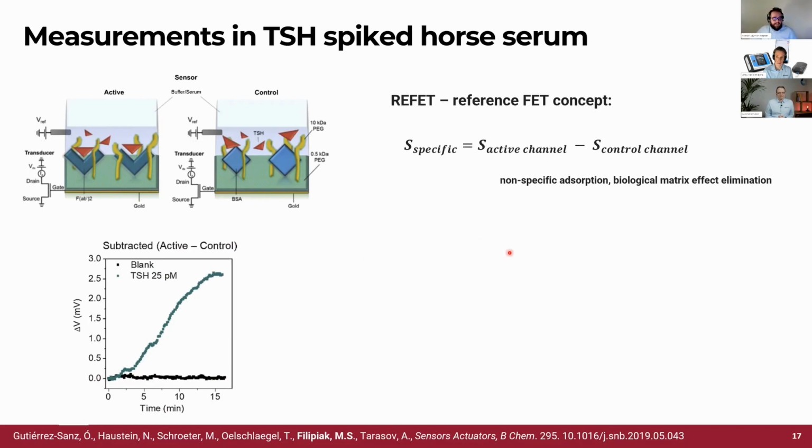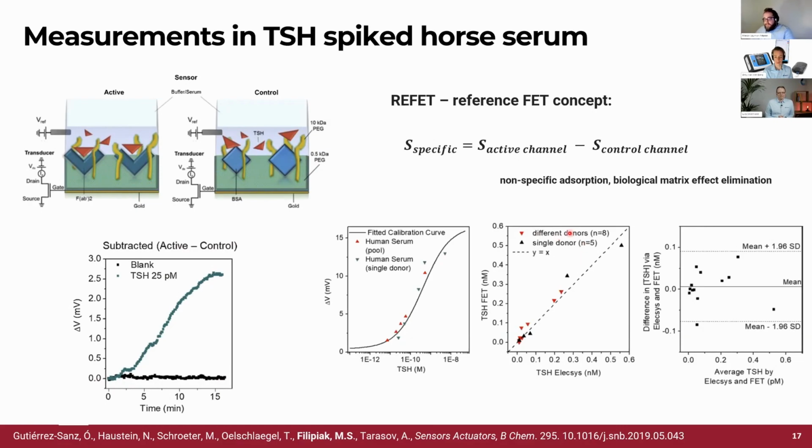What we then did is we also tested it against state-of-the-art equipment. Here, this was a COBAS system, a laboratory piece of equipment that Roche normally delivers to medical laboratories, like hospital laboratories. And this is based on electrochemiluminescence. We tested our method, this field effect transistor-based method, against their ECL method. And as you can see here in the Bland-Altman plot, the results taken from our FET technique do correlate with the results that we got from the commercially available state-of-the-art diagnostic system.